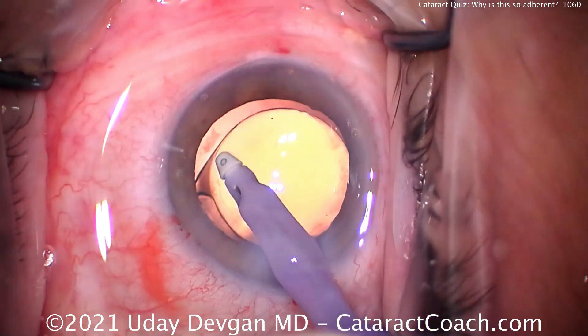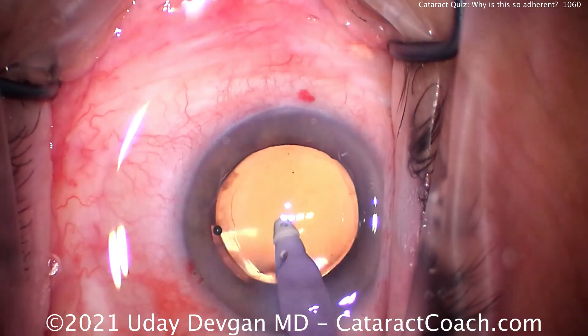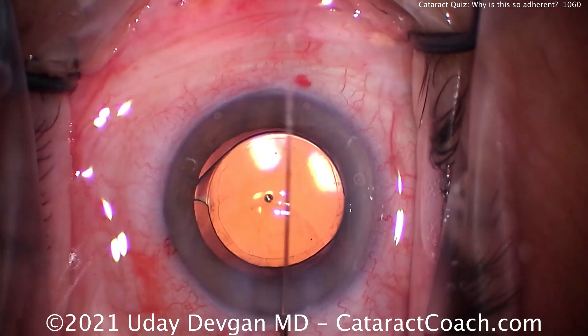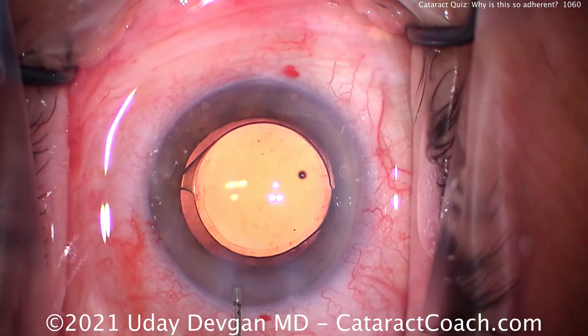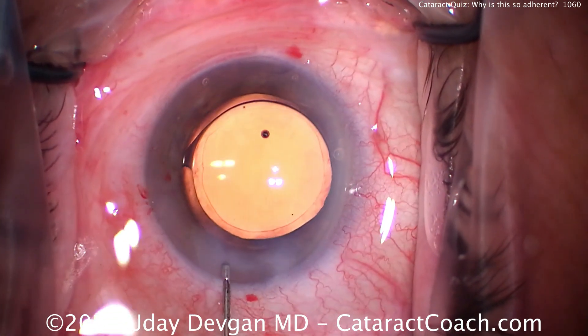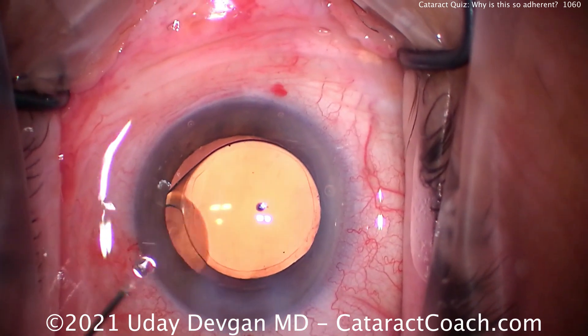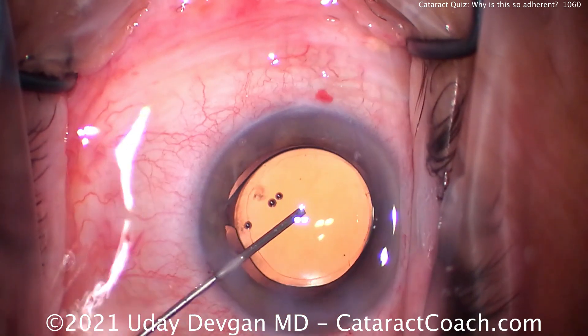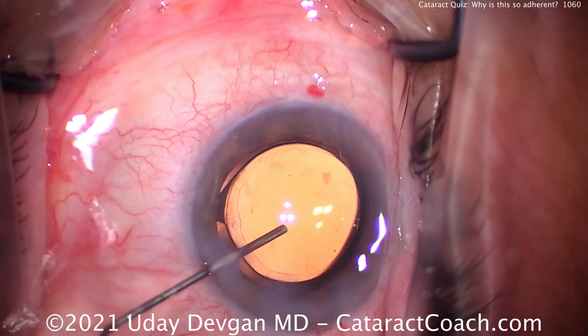What is that? That's grabbing the capsule! That's why it's so adherent — that's the capsule. Leave it alone. Notice how we caught that very early and we just reflux on the pedal — that'll reverse the peristaltic pump and release that vacuum. If you kept pulling on that you would absolutely break zonular attachments and you could damage the capsule.